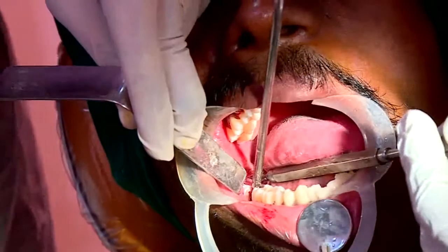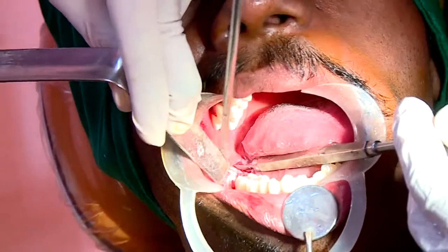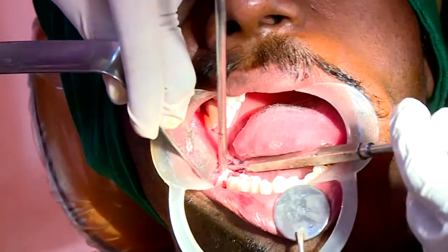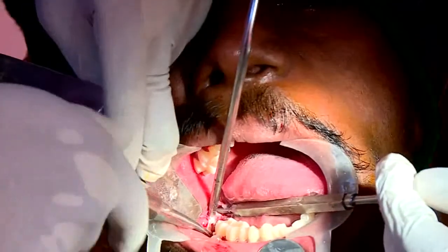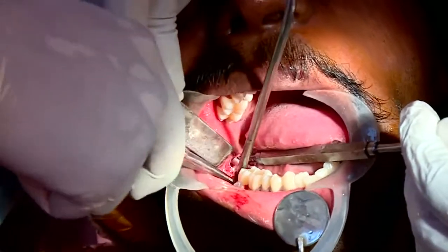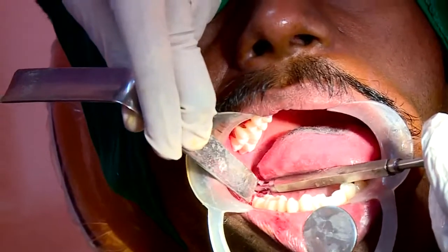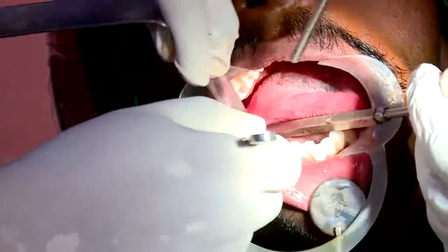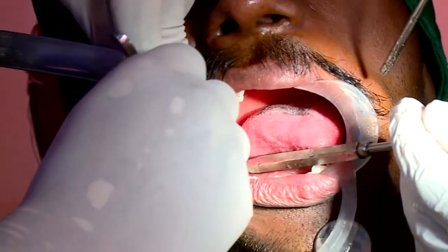Any doubts in what we are doing? Myself removing the bone, any doubts that you are having? One or two questions? Myself removing that part of the crown. No doubts till now.